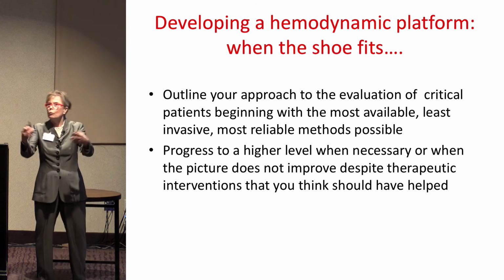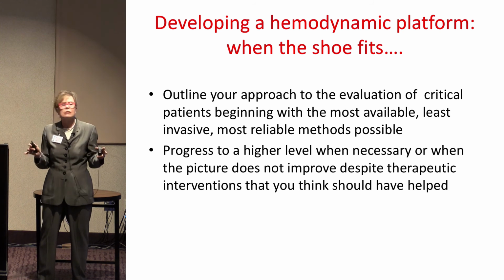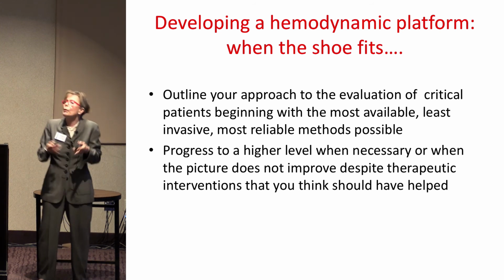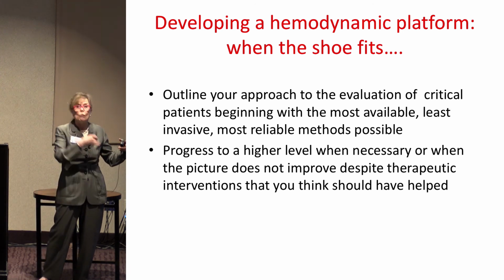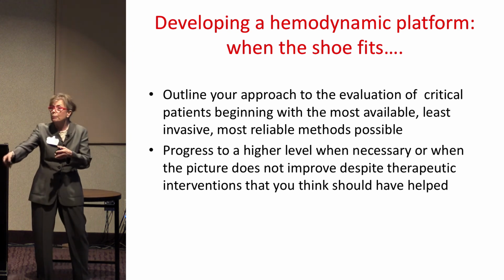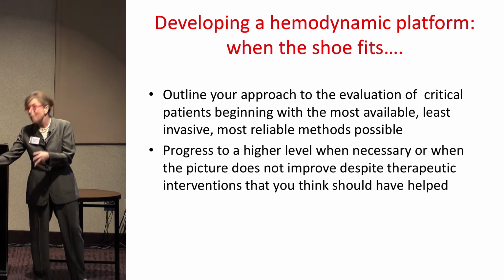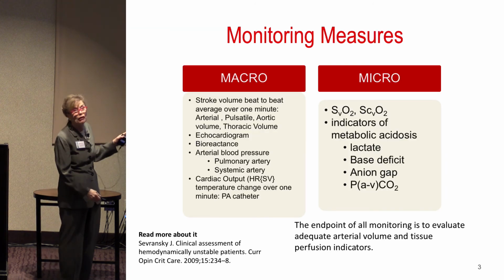There are lots of different methodologies that we can evaluate and use at the bedside, but we need a full platform that really guides us to understanding why we advance technology. So we might start with something non-invasive and laboratory analysis, move to minimally invasive and laboratory analysis, and then move to maximally invasive and laboratory analysis. And that's really what I'm going to cover here today.